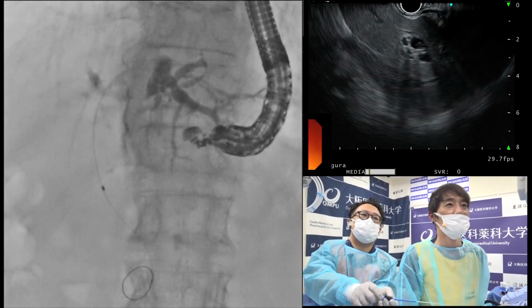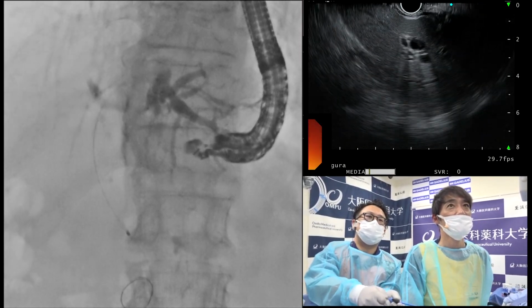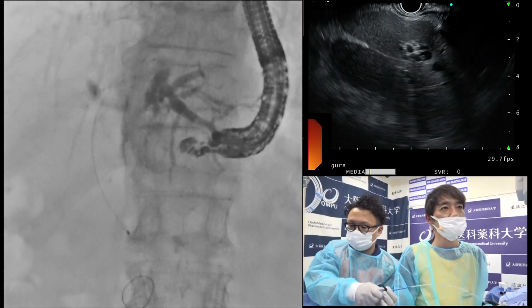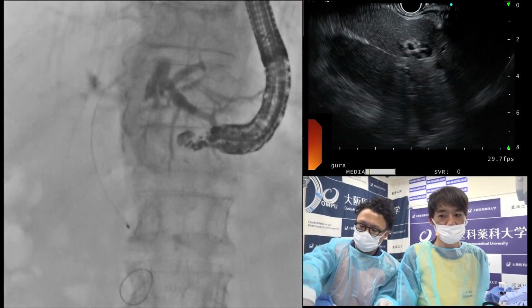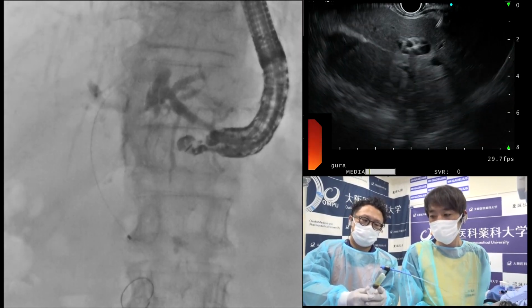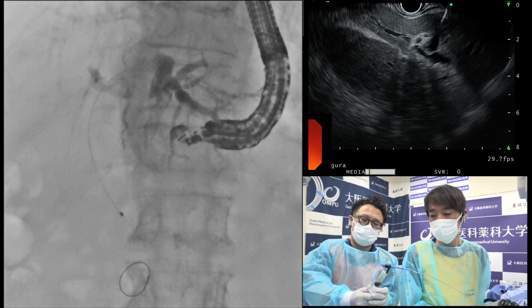After bile juice aspiration, we insert the contrast medium. Just tell us about the aspiration of bile. What is the intent of that? Is that for culture?